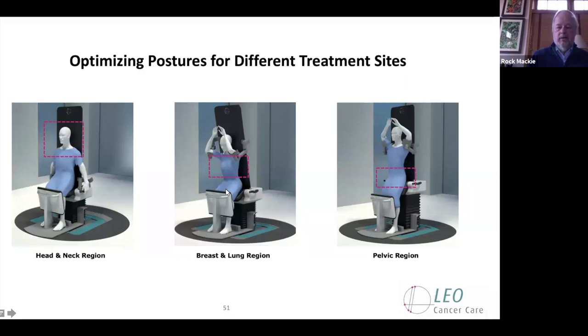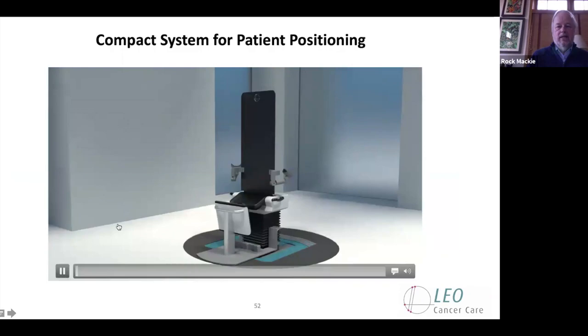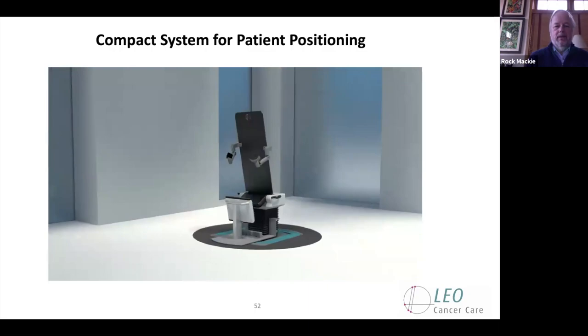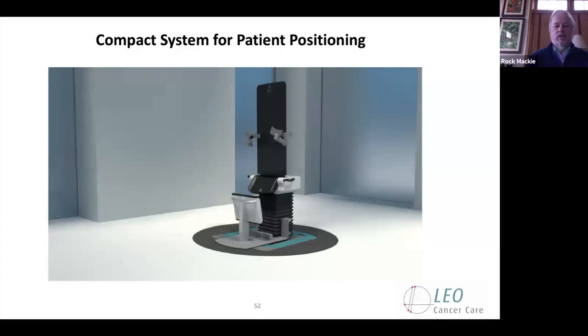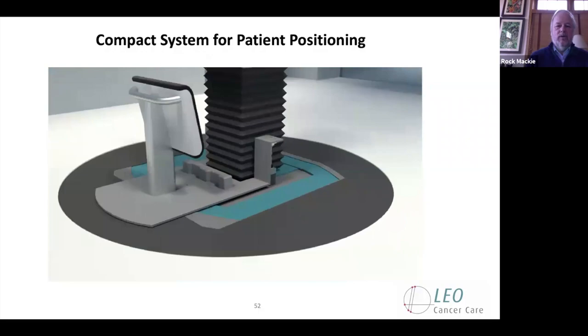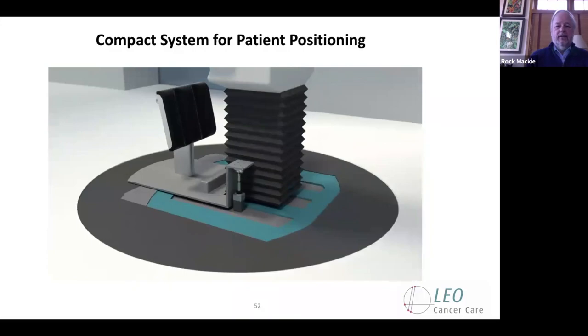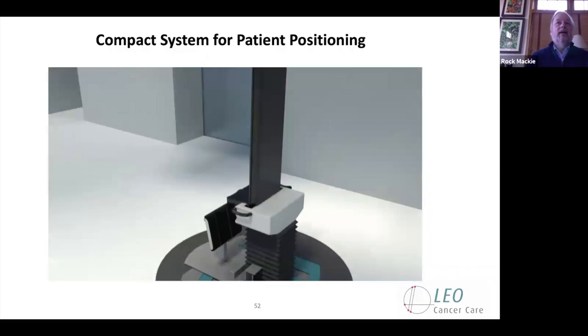So this just shows then the motion of the couch. You can change the arm positions. This is in the seated position. You can tilt it forward for breast, so the arms don't have to go as high up. Here is a perched position. And you see then here the 6 degrees of freedom. The translations can move around, so left, right, inferior, superior, as well as the tilts can be accomplished. And what you see then is you have a couch that's relatively easy to set up. You can pick the variety of positions and you can allow for adjustments after the CT scan or optical guidance.